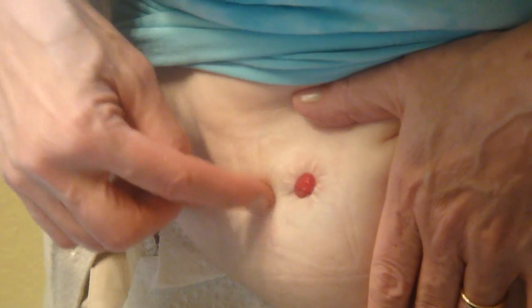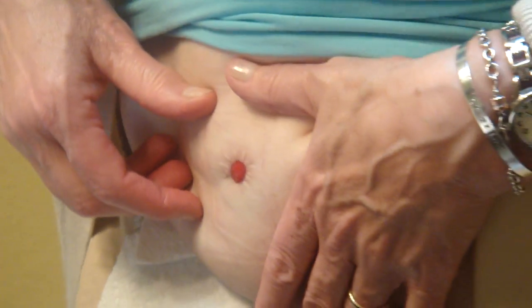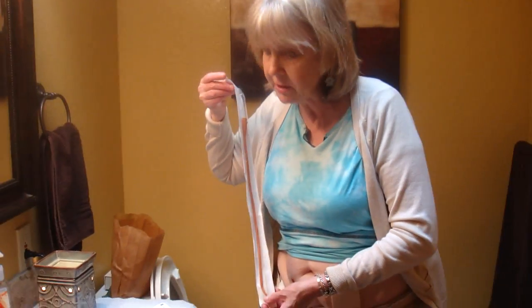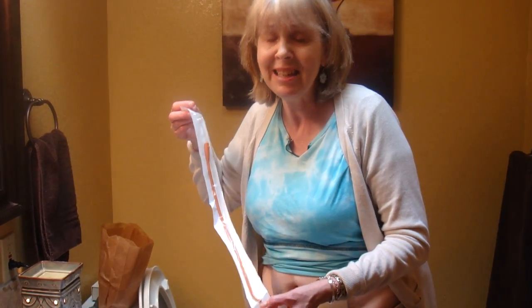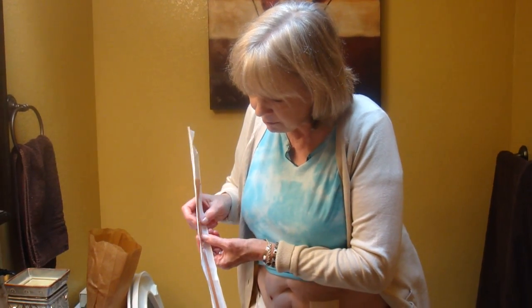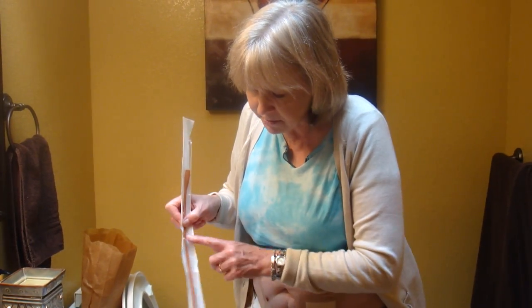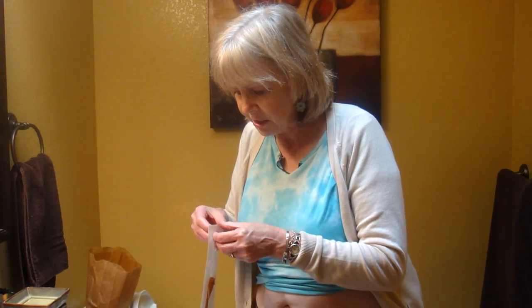If there was any mucus on it still, I would take one of these little wipes and wipe it, but it looks okay. I'm going to go ahead and take my catheter. It looks kind of long and this can be really intimidating when you've never done it before and you think, how is this going to fit? But it does, and I'm going to feed it in probably up to about that point right there. This much is going to feed in and it's really no big deal after you've done it a couple of times.